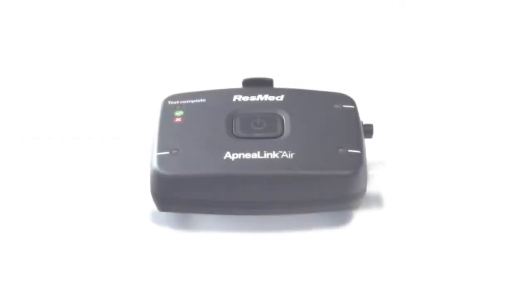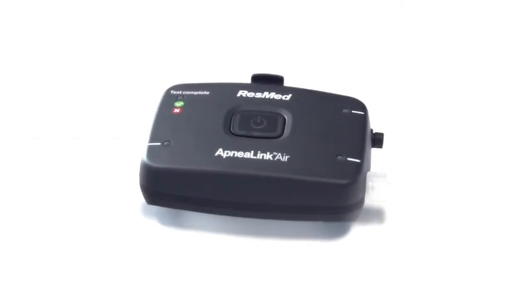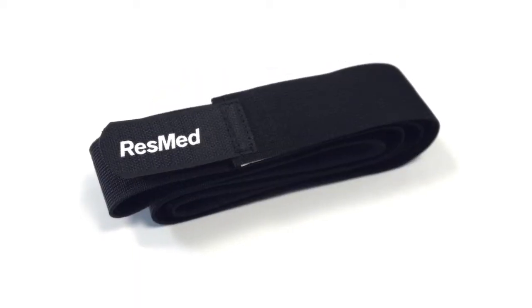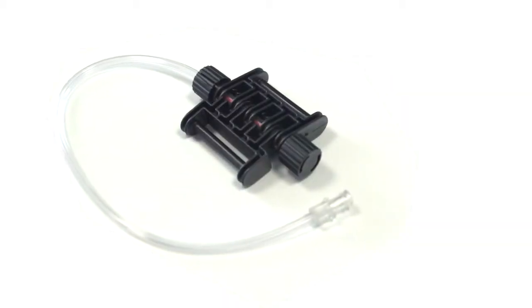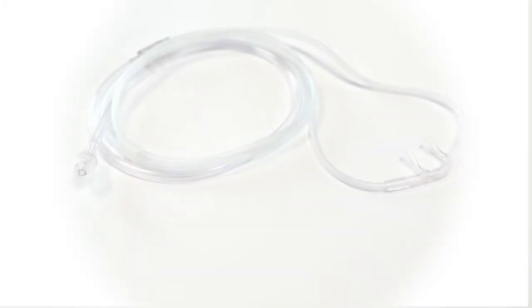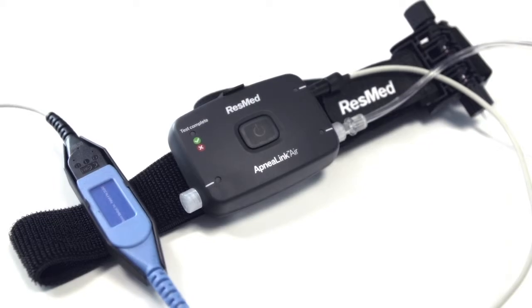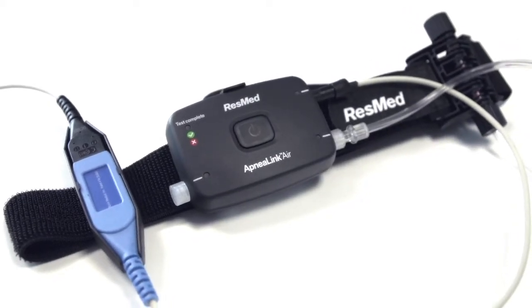When you open the pack you will find several components: the ApneaLink Air recorder, the belt, its effort sensor, the nasal cannula and the pulse oximeter. We'll explain each of these parts as we assemble the system.